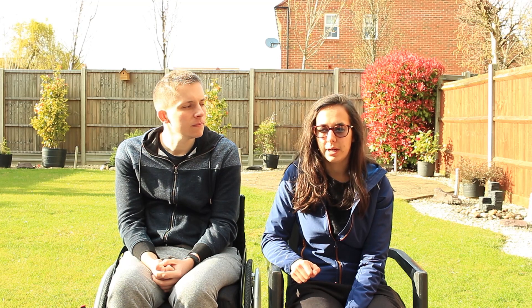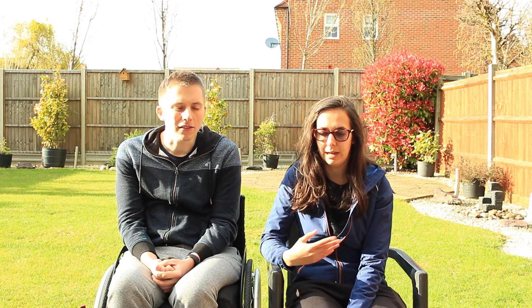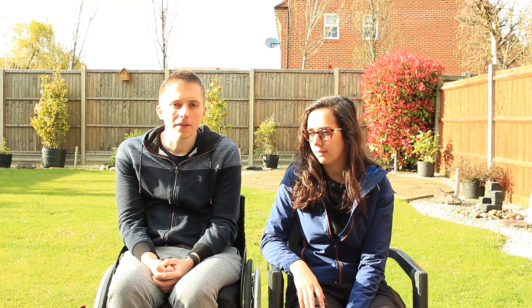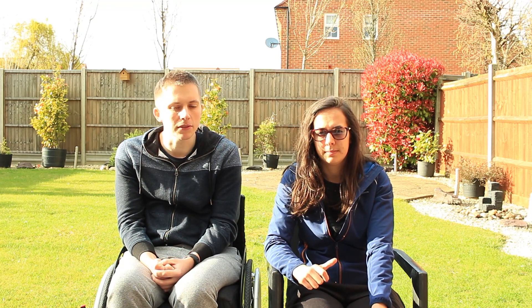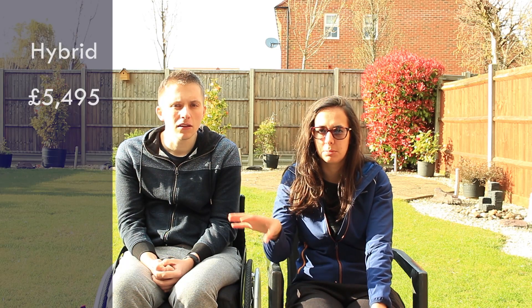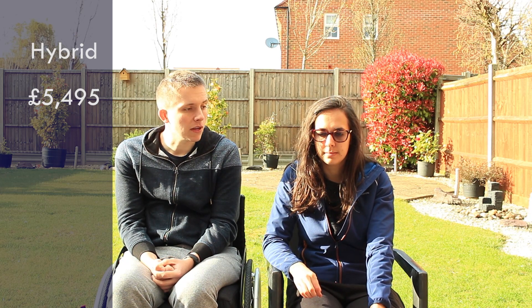It looks the most well-built. The other ones looked a little bit flimsy and I'd fear if you took them off-road they might break. The RGK one we tried back at Stoke Mandeville — just a little cable had broken and the electric power wasn't working at all. The caveat is that it costs more money. Most of them come in around four grand; this one's about five to six grand, so a little bit more. We'll put the actual price on screen.